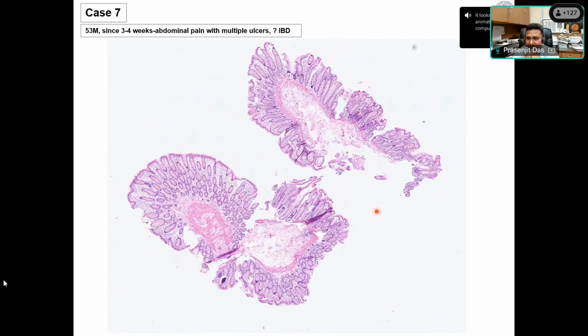Inflamed or not? If it is not, you can say not much. It's not that much inflamed, sir. Architecture? Architecture is somewhat crowded in appearance. So crowding or expansion, anything is distortion. So if you ask me, this area is normal. This area is perfectly normal.